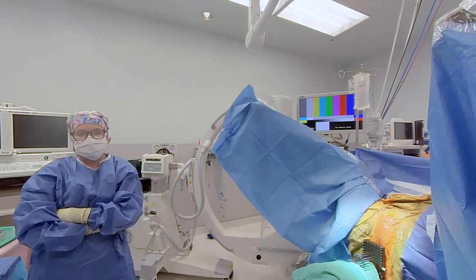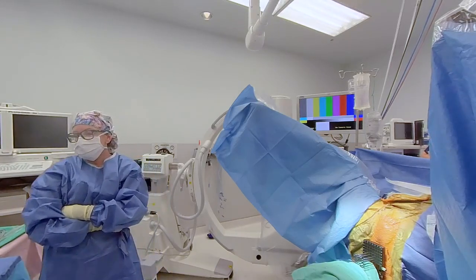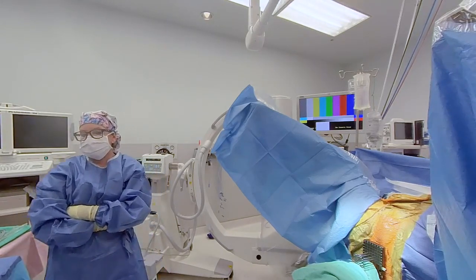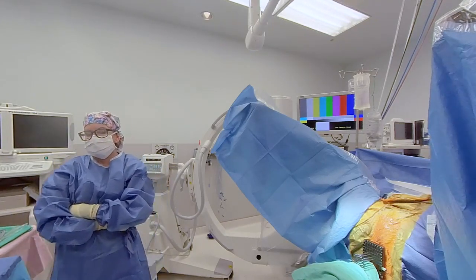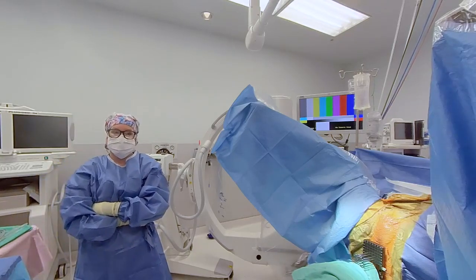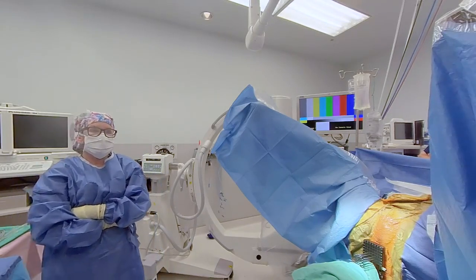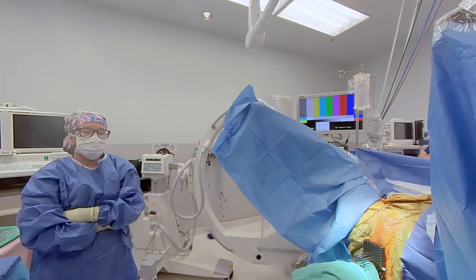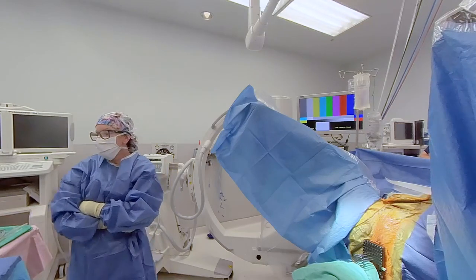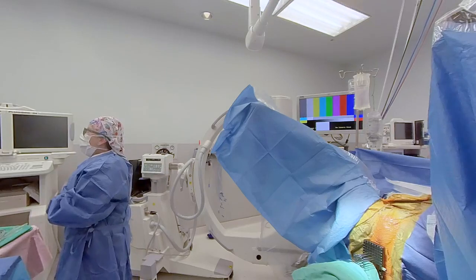This is an inverse planning algorithm that takes into account predetermined dose objectives and constraints that are mapped into the prescribed dose of 145 gray. The plan takes into account the parameters of the needles that were placed and stays within those parameters. Okay, so the next thing we want to do is make sure that we know what our seed strength is. So we go to source placement mode, and for simplicity, I just want to see a couple of the isodose curves, the 150, 125, and 100, and the 90%. Our seed strength is 0.451.